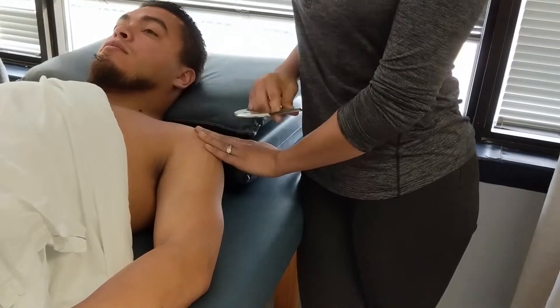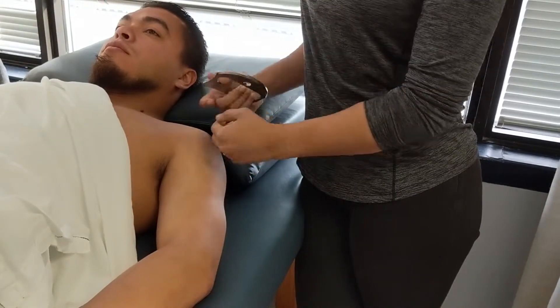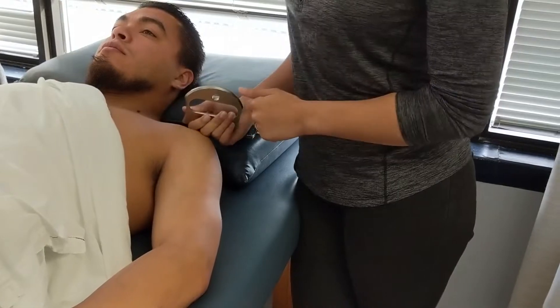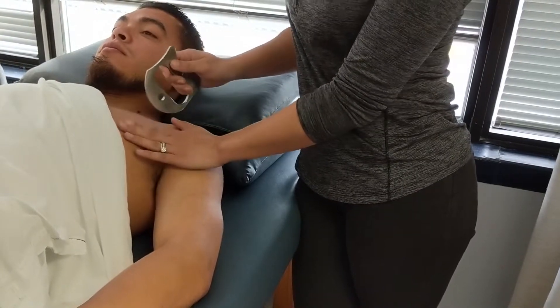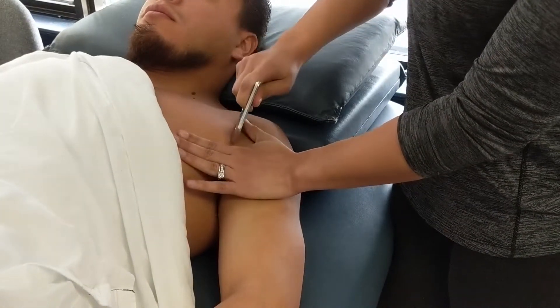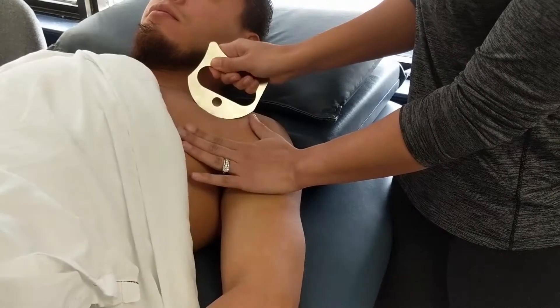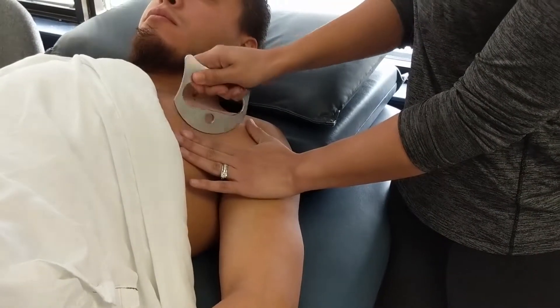Another technique we can use on larger muscle groups is the sweeping technique. At the pecs, I'll go in and use that sweeping technique — same thing, you traction the skin and do some gentle sweeping.